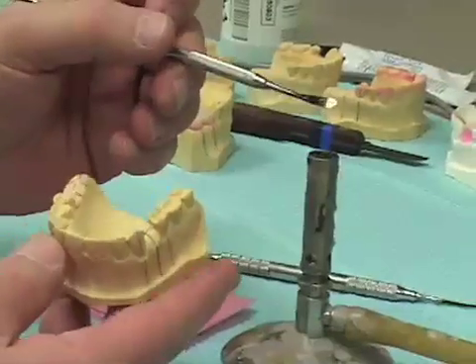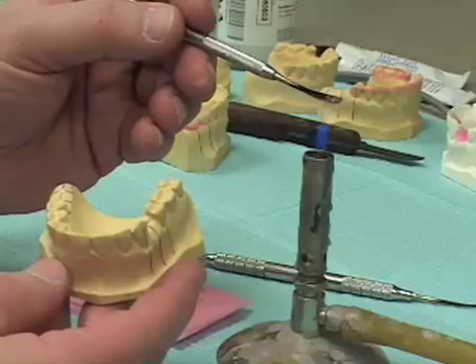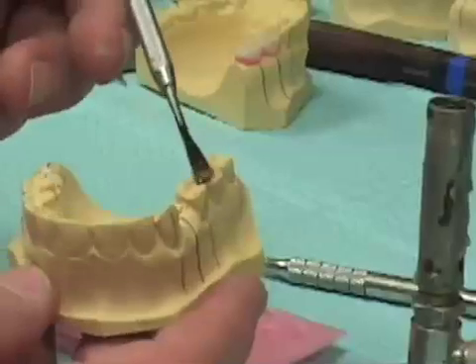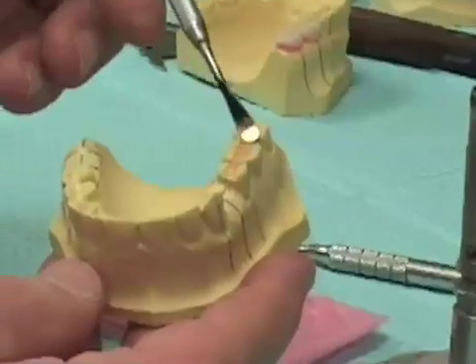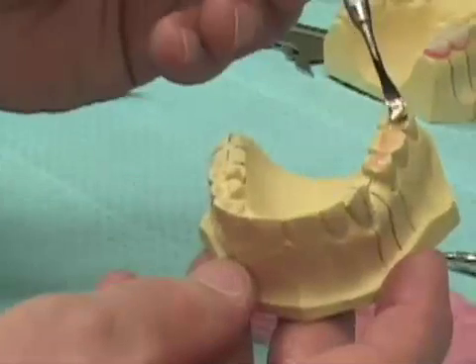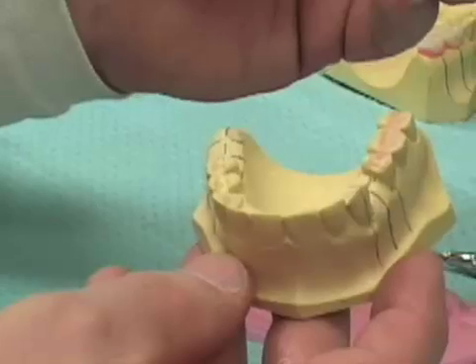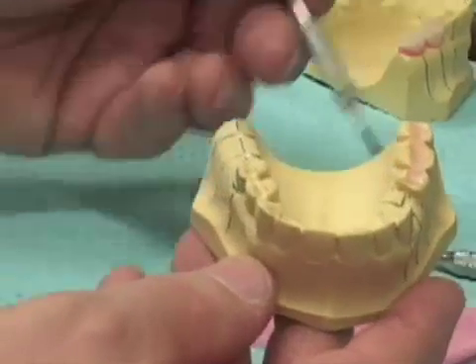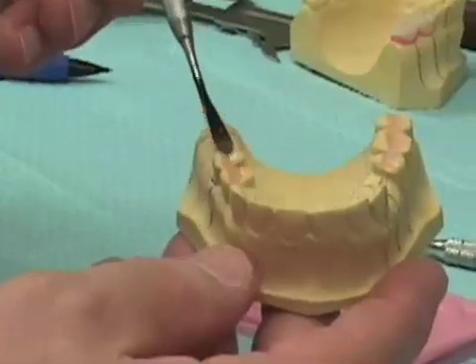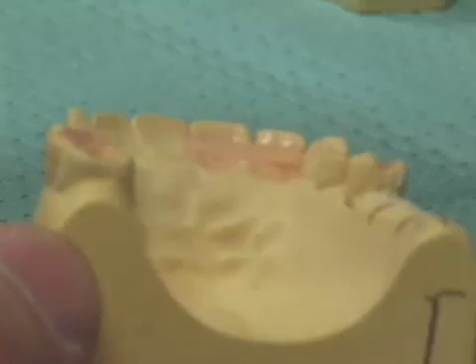With our number seven wax spatula and the pink baseplate wax, I simply heat the spatula. One of the first things I want to do is flow wax onto the occlusal aspects of the teeth so that I fill in the depth of the occlusal anatomy on the posterior teeth. I'm doing the same thing now on the bicuspids adjacent to the area where we'll be placing our implants, so I have the depth of the occlusal surfaces filled in.